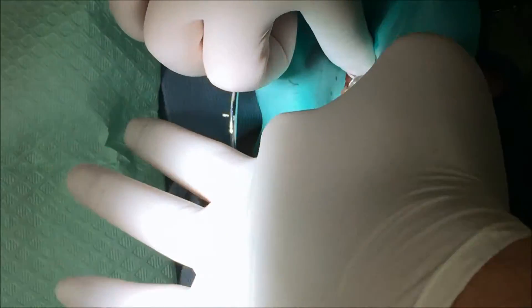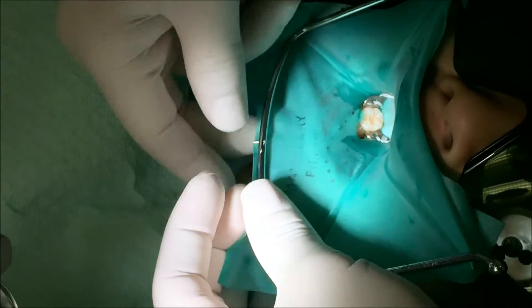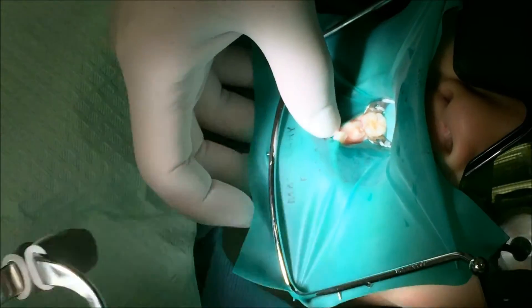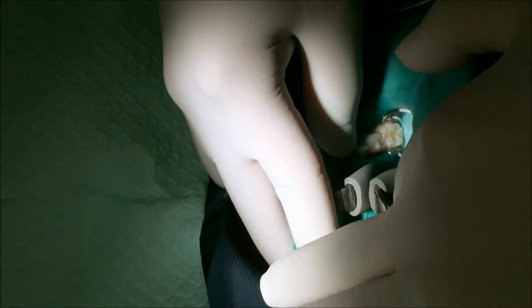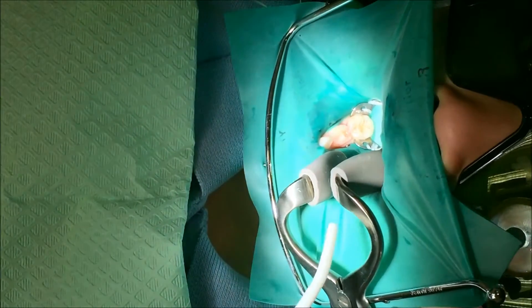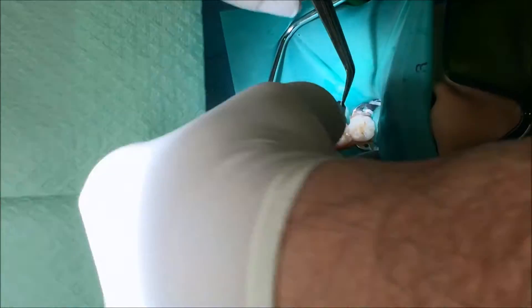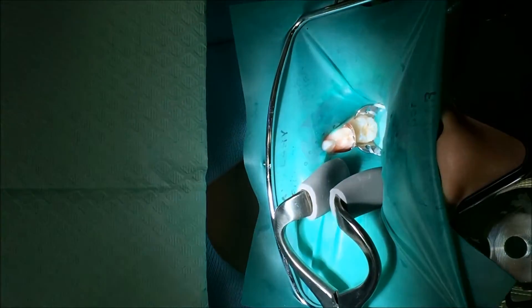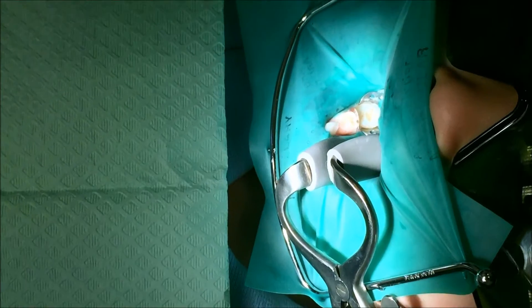I'm gonna put the umbrella on. Okay, today we're only working on one so it's gonna be super quick. Good job, thank you — you are the best. I'm gonna open up the umbrella here so that the water won't need too much. And this is the pillow here. Go ahead and bite down for me, sweetie. Good job. Can I have a tooth protector please, Carla? We're gonna protect the tooth in the back, and then we'll give your teeth a shower. You're gonna hear a little popping noise, just like how you make popcorn at home.